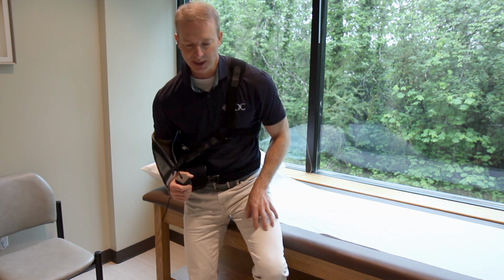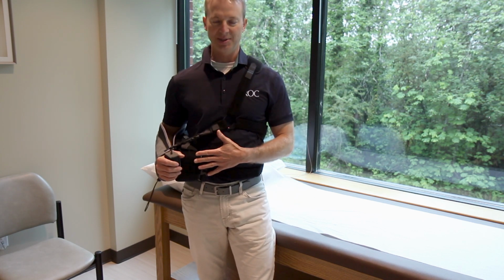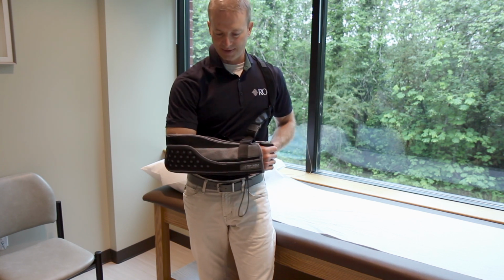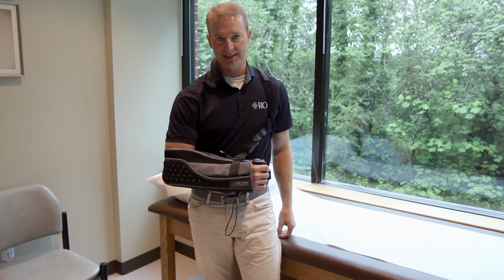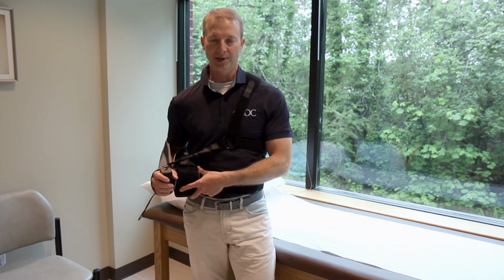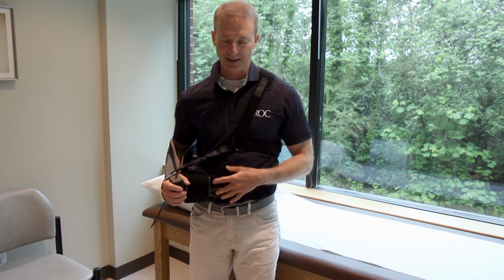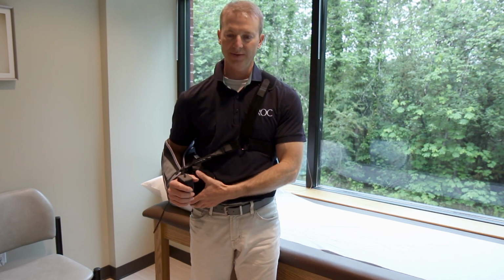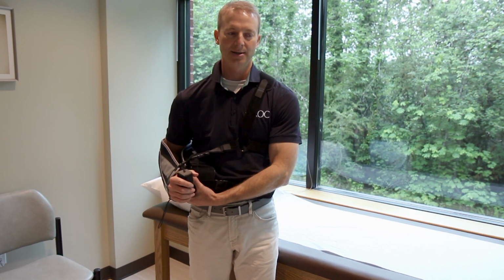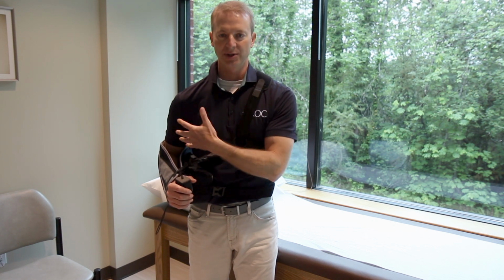So in general, after shoulder surgery, I like the sling to be positioned on the patient's side as opposed to having it be worn across the front like this. So I think it makes it easier to recover post-operative range of motion if it's worn over here on the side. Generally, the strap should be tightened to where it's supportive, to where you feel like the sling apparatus allows you to relax into the sling and take the weight off of the shoulder.